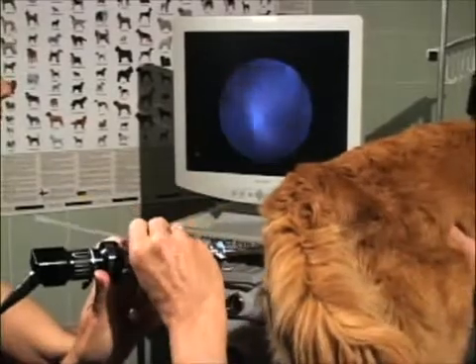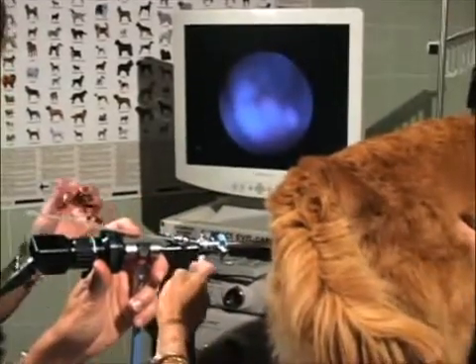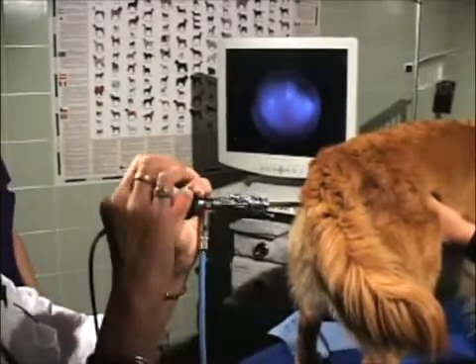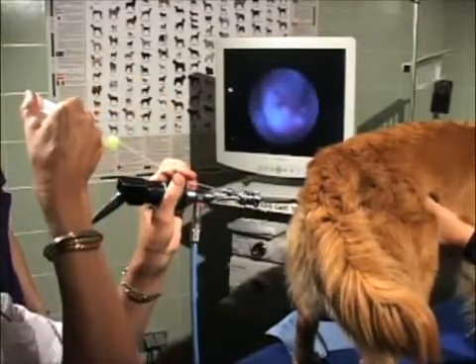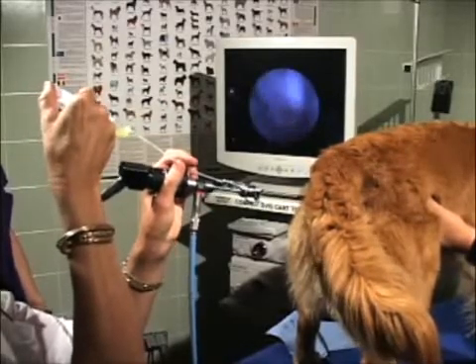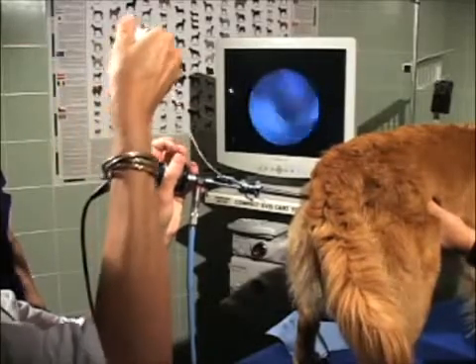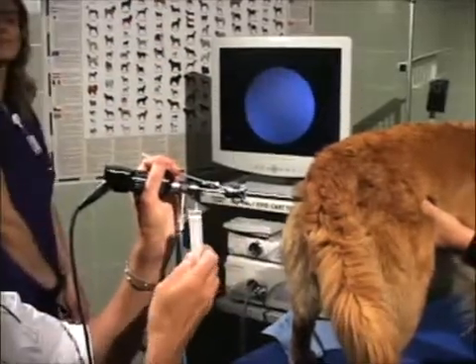Once visualized, the polypropylene catheter is advanced into the os slightly. The scope must then be lowered so that it is parallel to the cervical canal, permitting the catheter to be advanced into the uterus. The catheter should be passed as far cranially into a horn as it will go comfortably. No more than 2 cc's of inseminant should be placed through the catheter to reduce reflux into the vagina. Observe for reflux initially, and if present, reposition the catheter. Use a small amount of air to empty the entire dose from the catheter lumen.